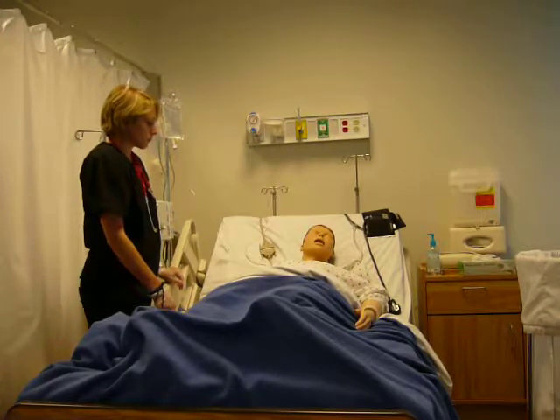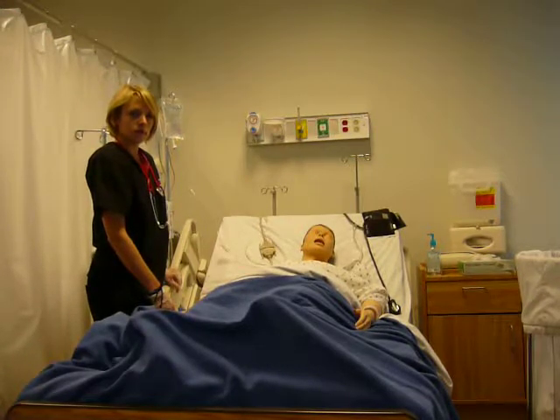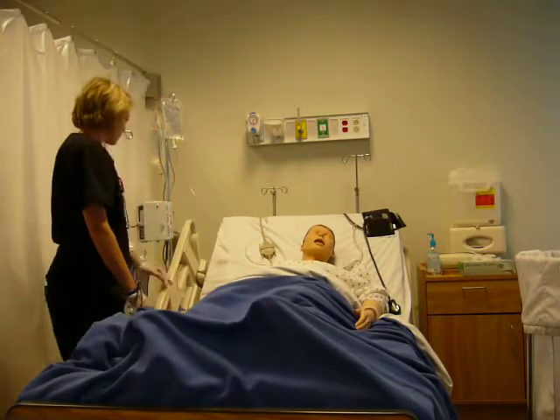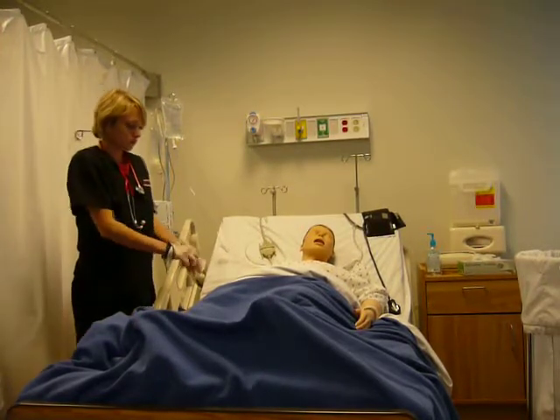You would change the dressing every 24 to 48 hours using aseptic technique or per facility protocol, and you would want to change infusion tubing every 48 hours. Once you are done caring for the patient, you would remove your gloves and perform hand hygiene.